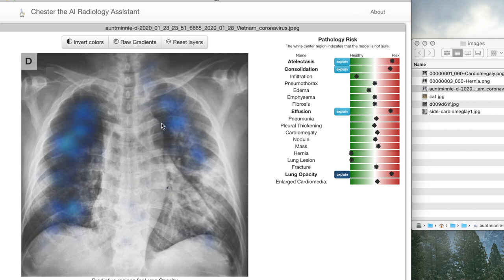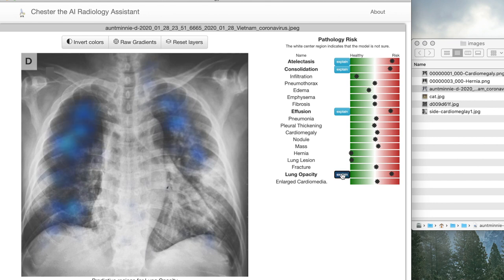In this explanation shown on the image, which we'll call a saliency map or the gradients, this is an approximation of what the model used to make that prediction. So here, for the lung opacity prediction, we can see that it's highlighting opaque regions on this image. What we can do is toggle on and off those saliency maps to get a feel for what parts of the image are being used, and we can switch between a variety of the tasks that are being predicted.